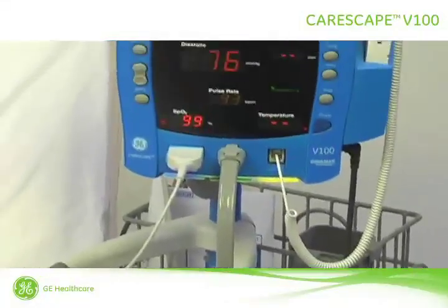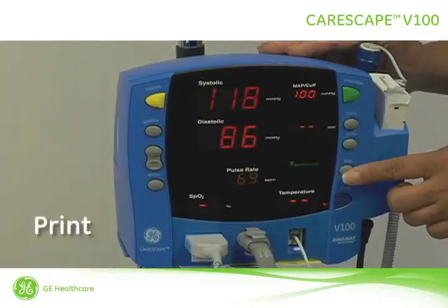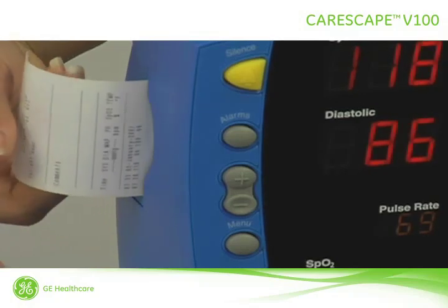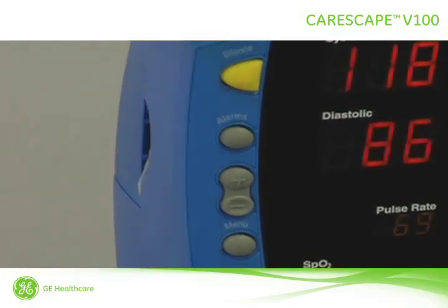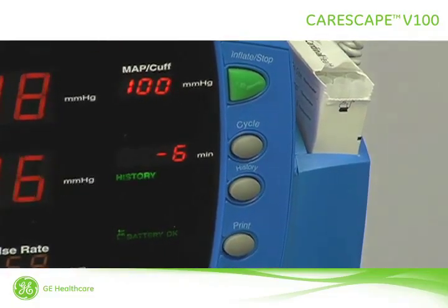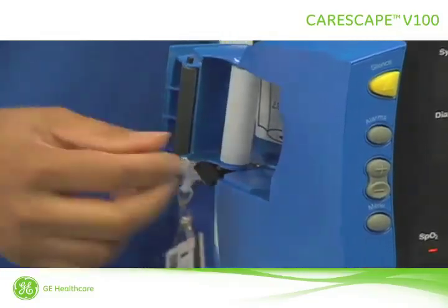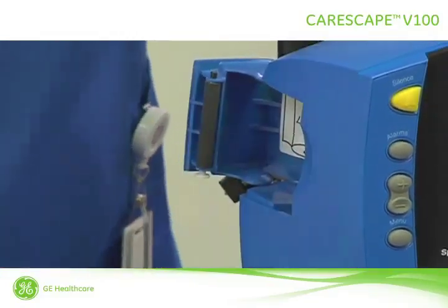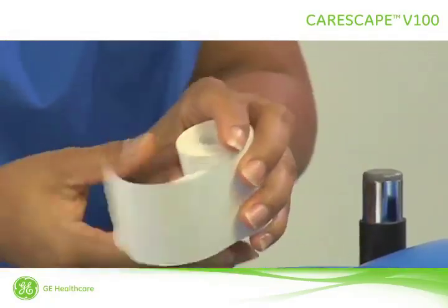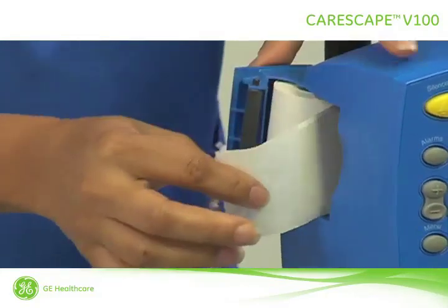Now let's take a look at the rest of the buttons on the Carescape V100 monitor. Pressing the print button will print the currently displayed values. To print all of the values stored in the monitor, press history and then press print. To change the printer paper, first open the printer door and remove the empty roll. Hold the paper roll and pull out a small amount of paper as a leader. Insert the roll onto the paper holder, then close the door while holding the paper leader.